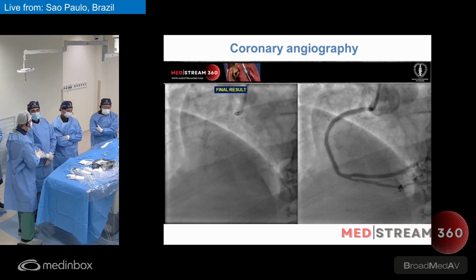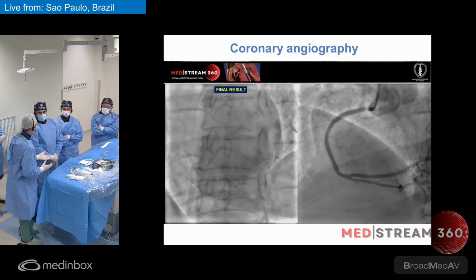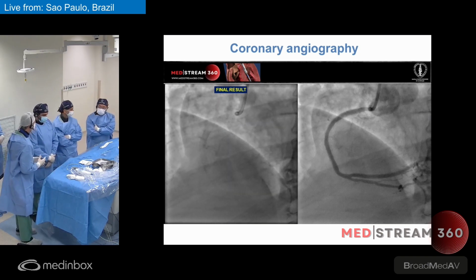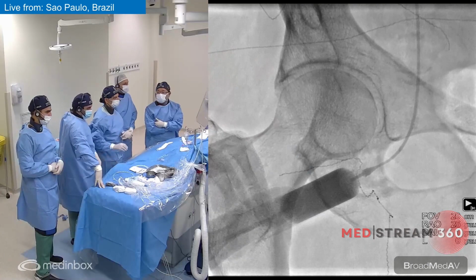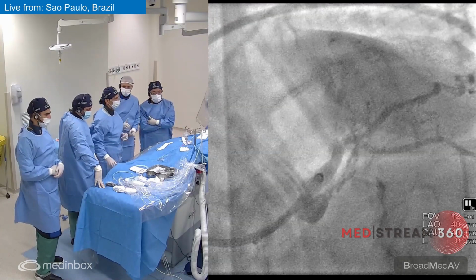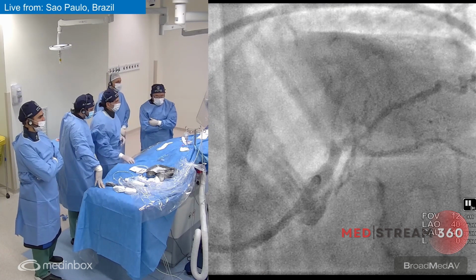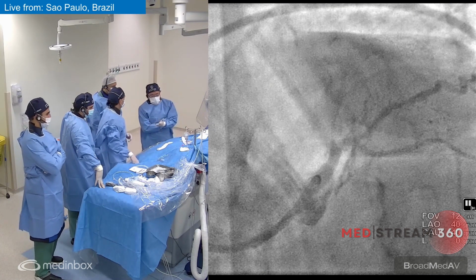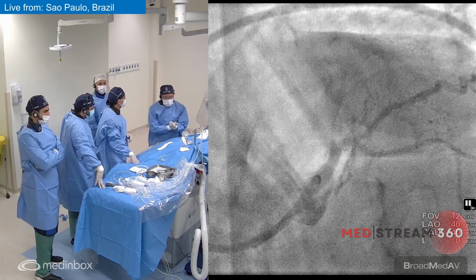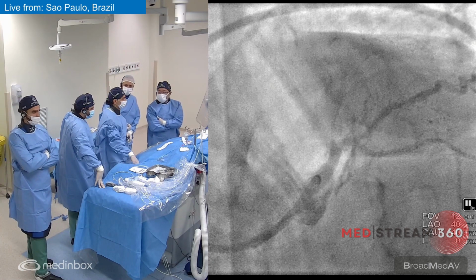And I see, Louis, you have a femoral access with a 7 French EBU 3.5. So, Louis, what's your strategy now? What do you think and do? I think so. The J-CTO is 1, no previous attempt as well. We're going to do it with a PT2 polymeric, hydrophilic wire. Do you think that's a good strategy, Rodolfo?